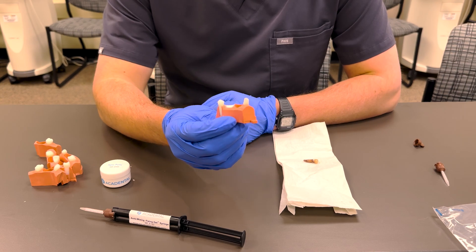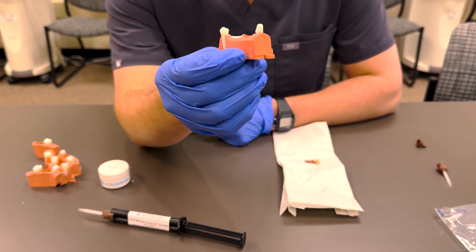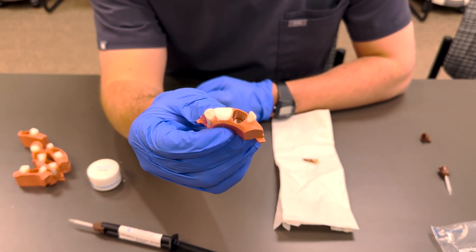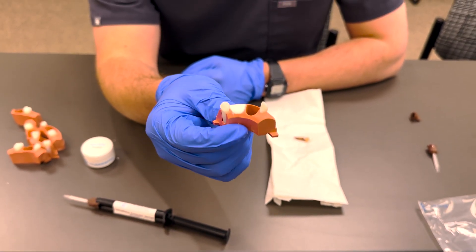I'm going to go ahead and do that. It should look something like this. I like to fill it pretty much all the way up with the apex putty and make sure it's nice and smooth and fully condensed, because if there are voids they will show up in the radiograph.